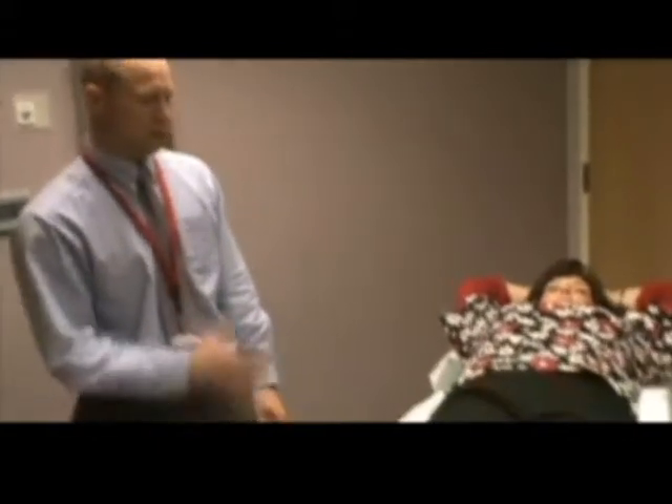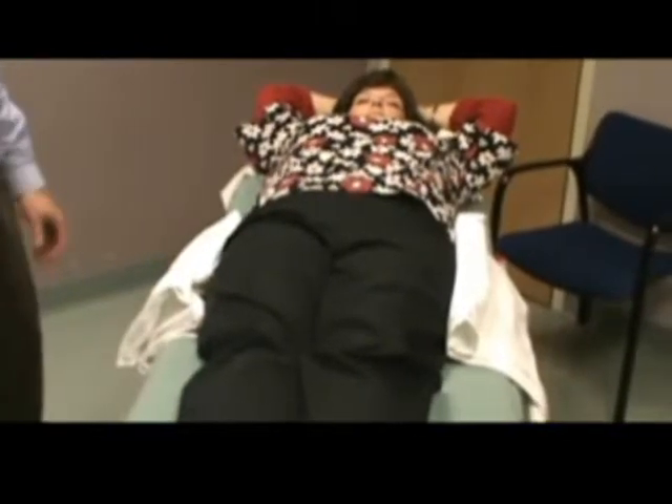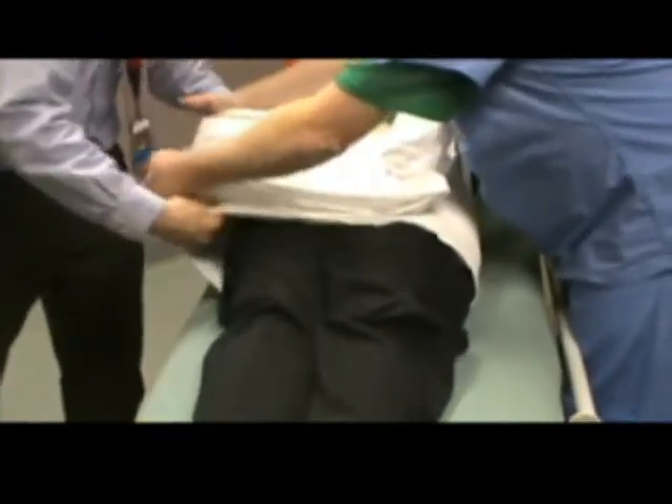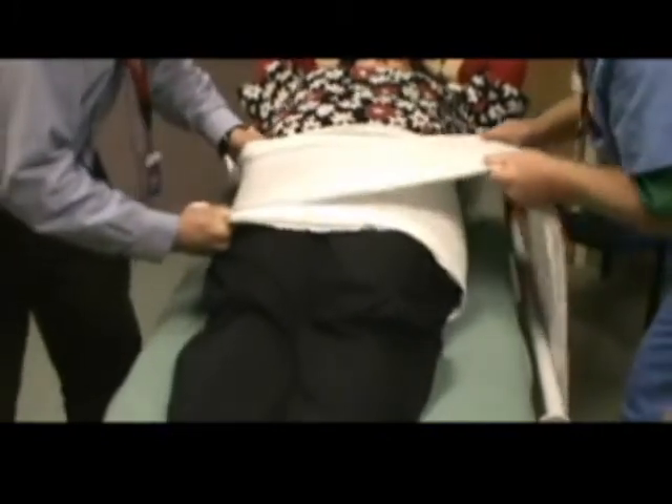We've taken a normal hospital sheet and folded it up so that there are no wrinkles present. It's placed underneath the patient from the iliac wing to the greater trochanter, and it takes two individuals to apply the sheet. The goal is to provide compression from the iliac wing to the greater trochanter, prevent any wrinkles, so it provides uniform compression.